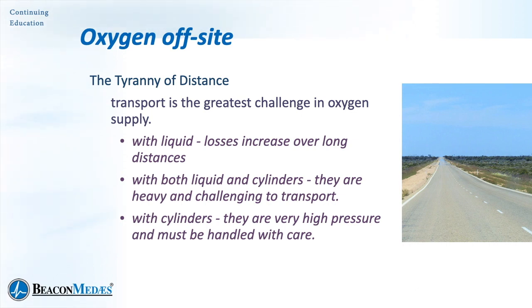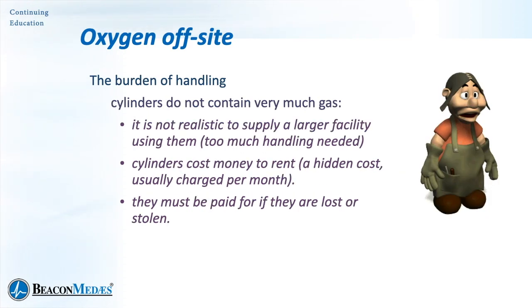In both cases of liquid and cylinders, they're very heavy, very challenging to transport. And with cylinders, the pressure is very high, 2200 psi typically. They have to be handled with appropriate care. And that's one of the things about having oxygen delivered is we do have that burden of handling.